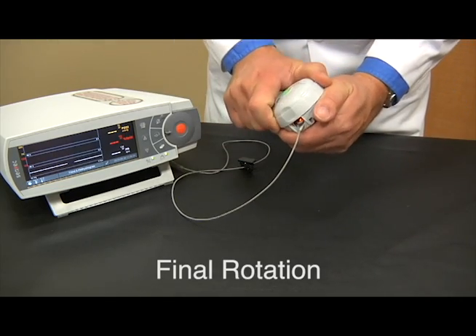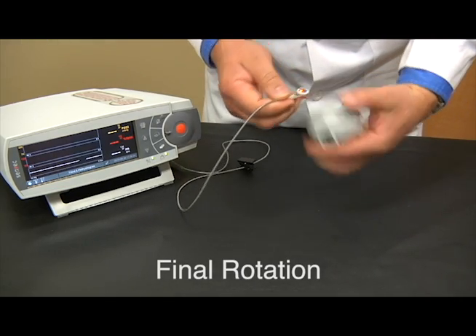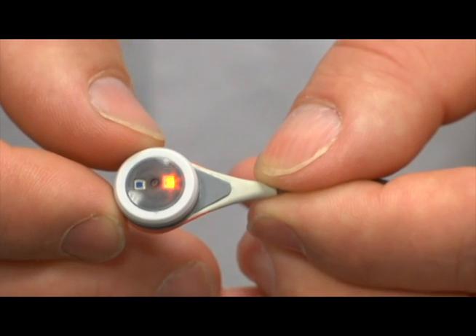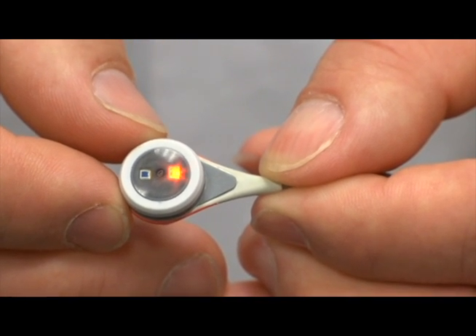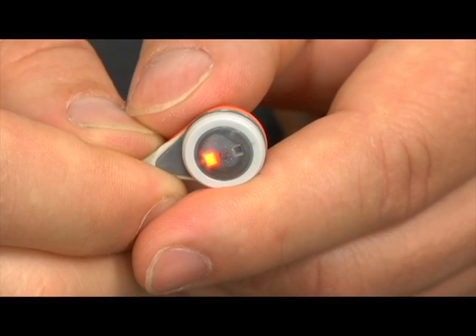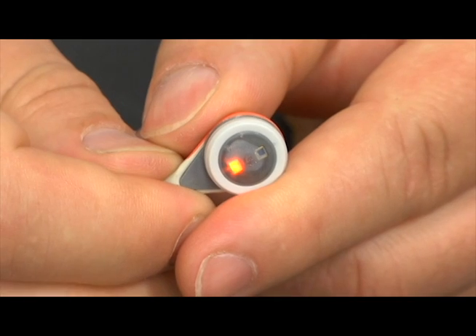You can now pick up the membrane changer and turn it clockwise one click for removal. Inspect the edge of the sensor and make sure the membrane is fully seated on the sensor. Upon removal of the sensor from the membrane tool, inspect the membrane face ensuring there are no air bubbles or damage to the membrane.